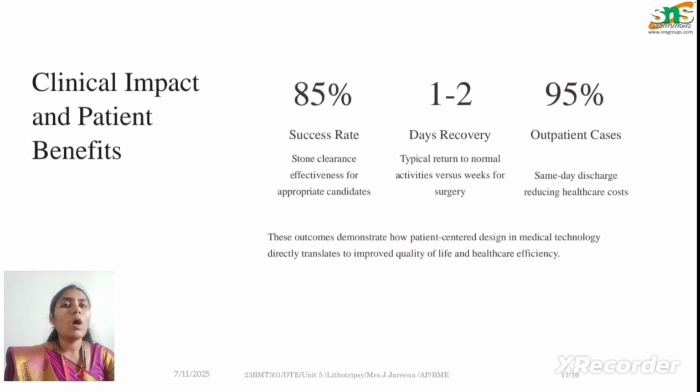So what is the outcome of this lithotripsy, and what are the benefits to the patient? Lithotripsy has an 85 percent success rate. It means it clears the stones very effectively for most people with kidney stones. Recovery time does not extend more than weeks. Within 1 or 2 days, people recover and start doing their daily activities. And it is a fully outpatient procedure, with 95 percent being outpatient cases only.